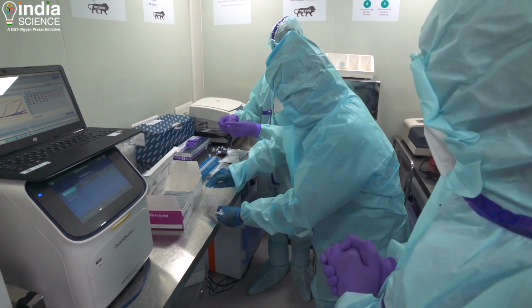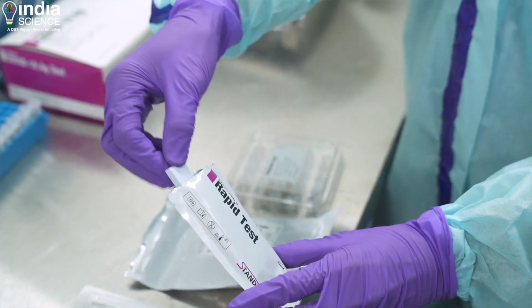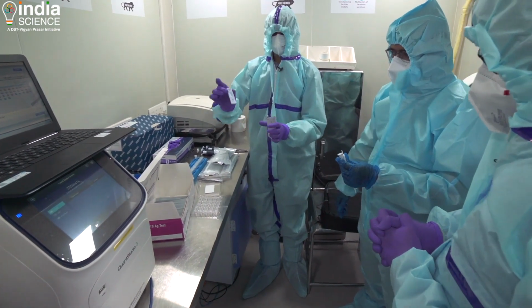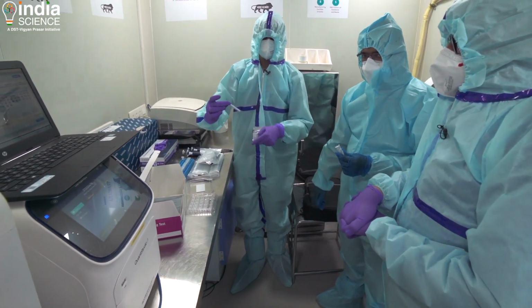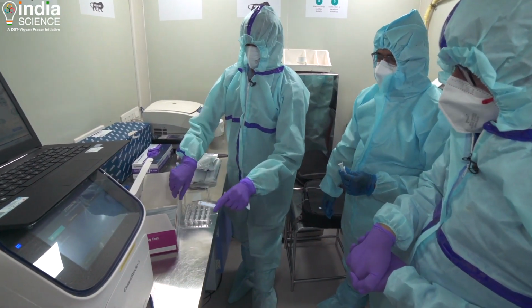Right now we are looking at the rapid antigen test. How long does it take to give a result? It takes 15 to 20 minutes. So it's much faster. The other takes hours and this takes 15 minutes. This is how a cartridge looks, and this is where you add your sample. And you detect a control band and a virus antigen presence band.